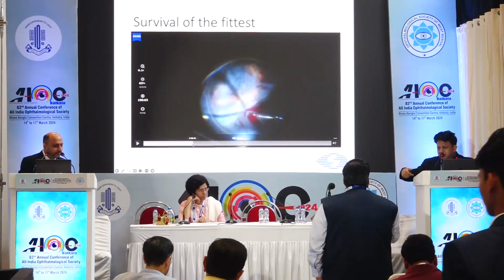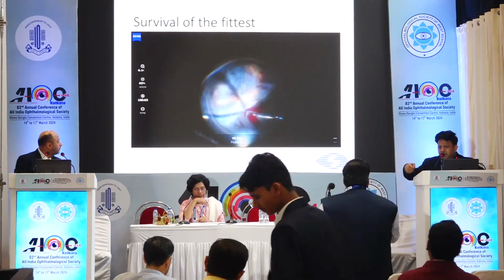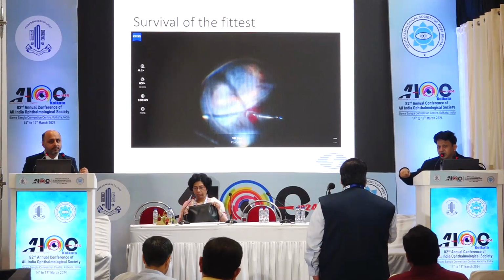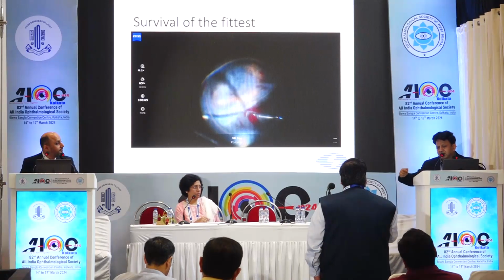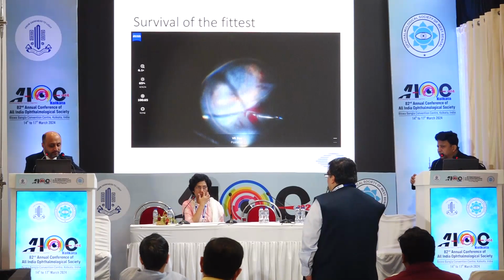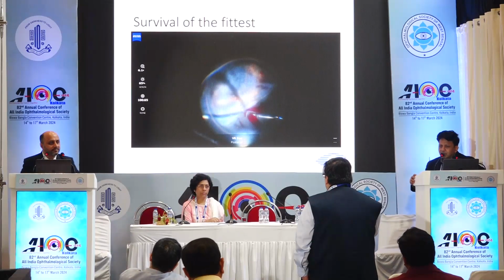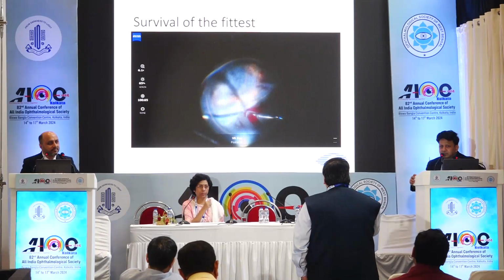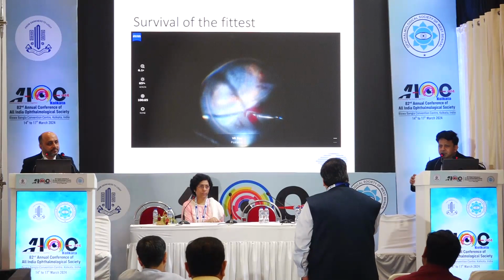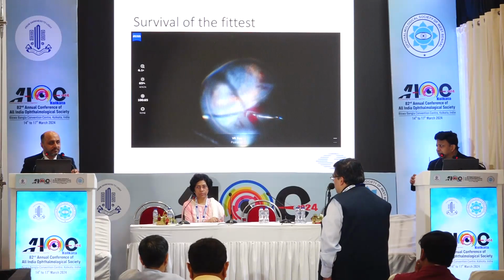So just go in, hold it from there and just pull it off a little bit and it would come off. Now, because of the smaller gauge, I'm not using that particular instrument, but it can also be used. Another thing, intraoperative OCT again helps here. On intraoperative OCT, one can actually find the plane where the hyaloid is already slightly lifted off the disc, and you go in that region and just pull it off. It comes off easier. Right.